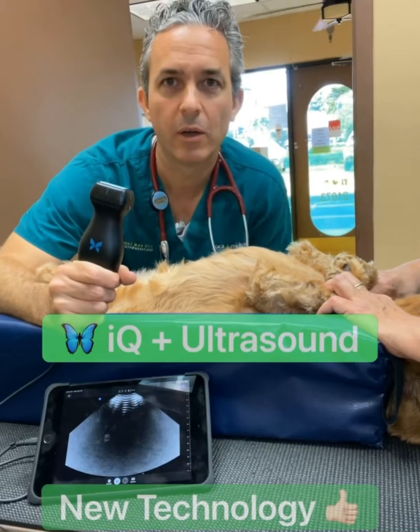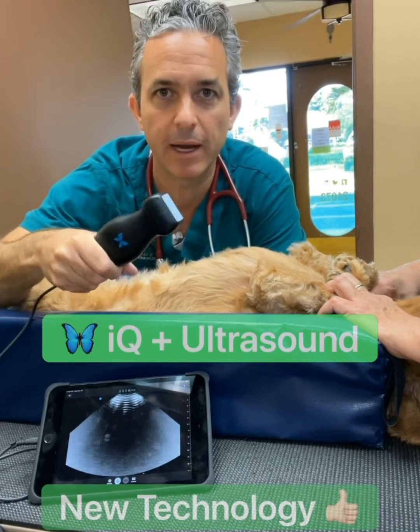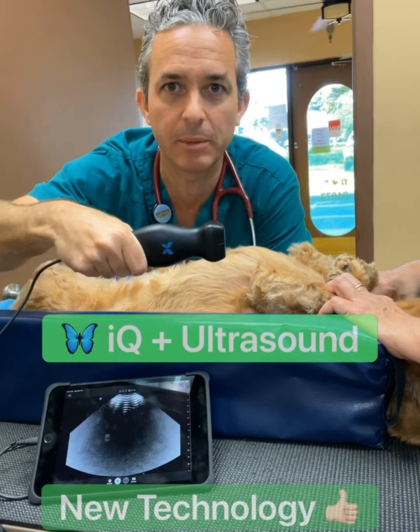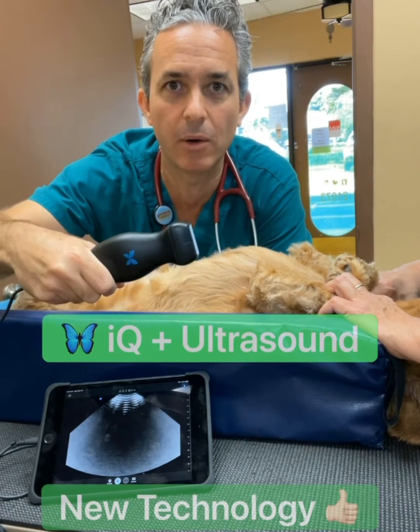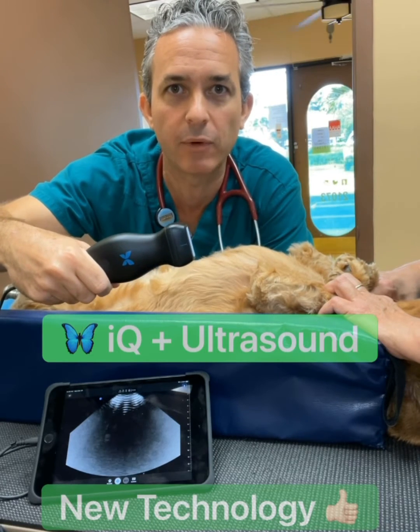Here you can see in my hand is the new ultrasound probe. It's made by Butterfly. It's an amazing piece of technology — it plugs right into this iPad below, and it's going to help us get a sample of Ruby's urine directly from her bladder.